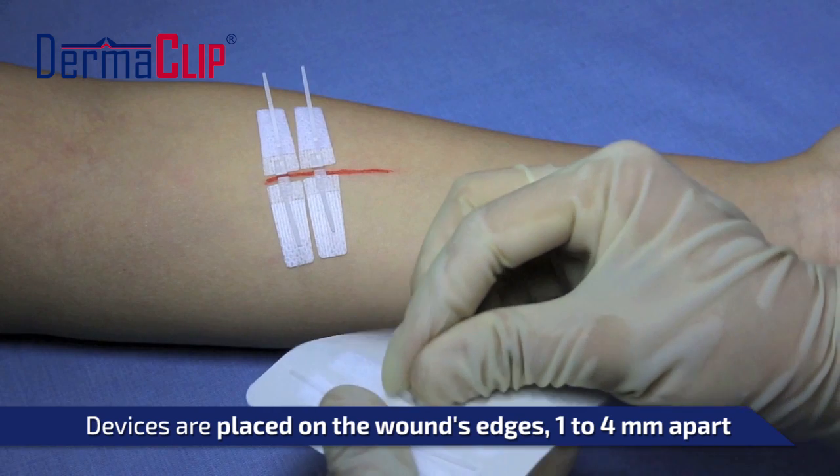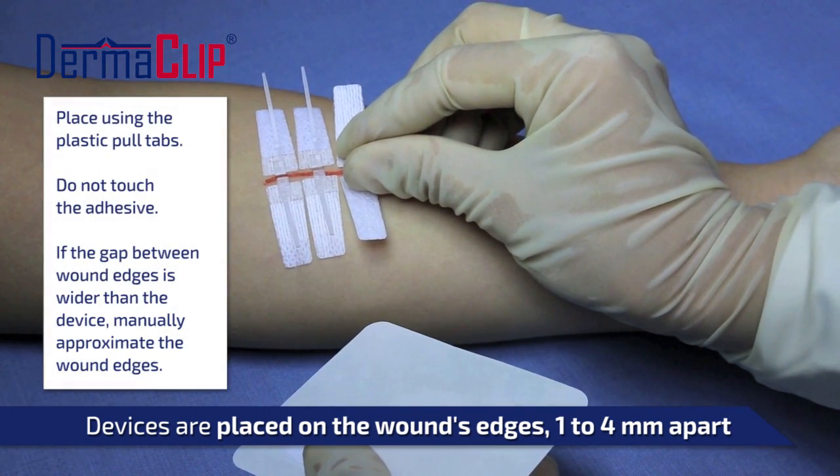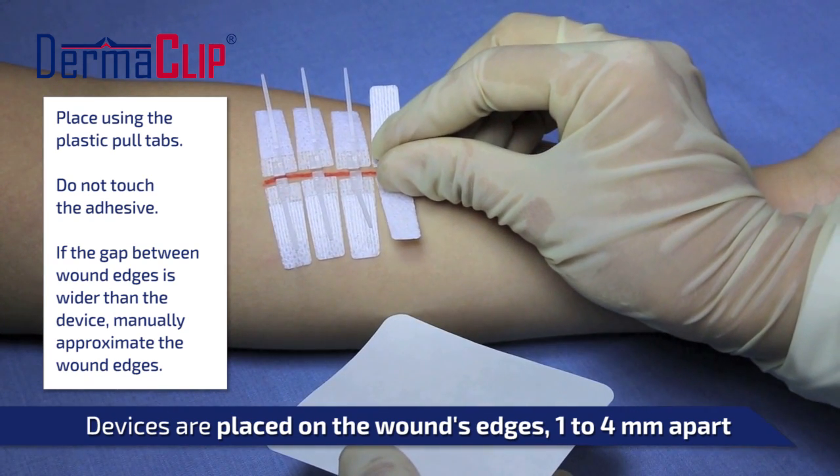To apply Dermaclip, grab the device by the pull tabs to avoid touching the adhesive pads. Then manually approximate the wound edges and apply the device with the locking mechanism lined up with the center of the wound.